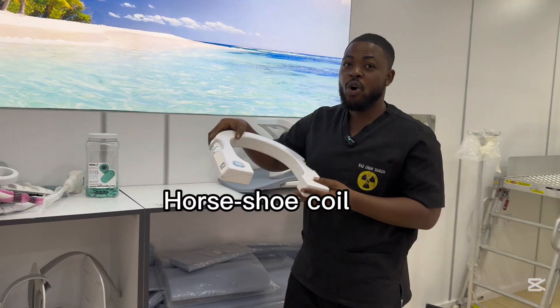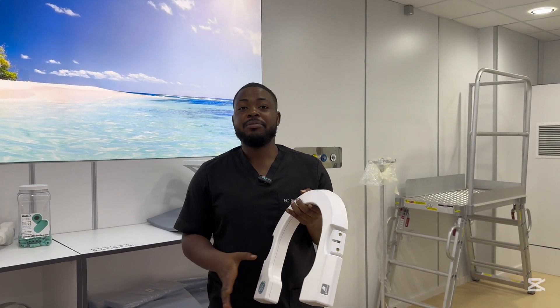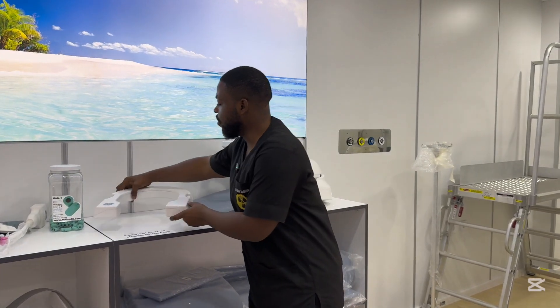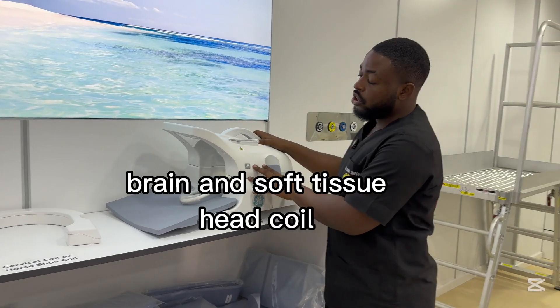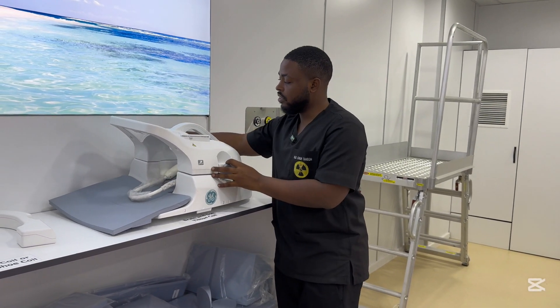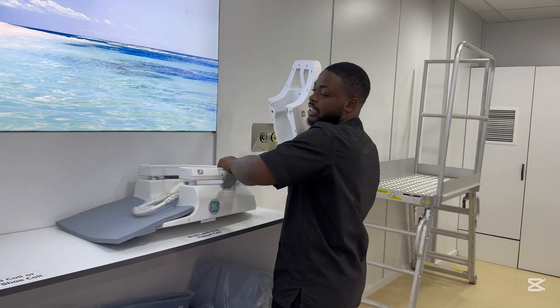This is a cervical horseshoe coil. We use it for the lumbar vertebrae, cervical vertebrae, and thoracic vertebrae — basically the entire spinal column. Then these are our brain and soft tissue coil — we use it for the brain and neck. To attach this one, we take off the other part, put this one in, and clip it.